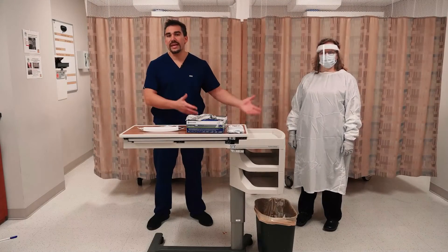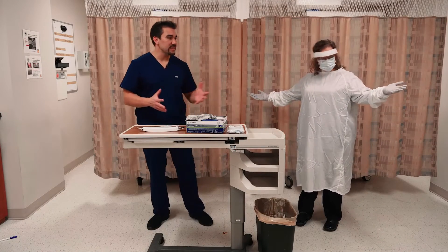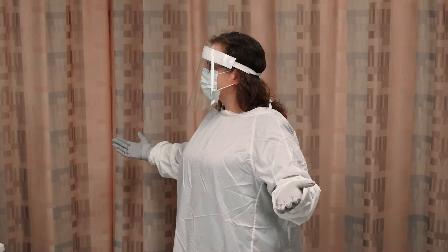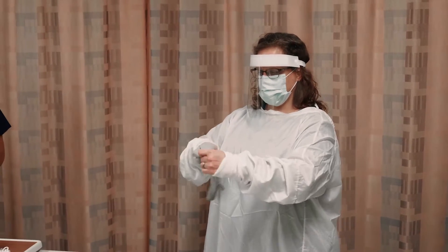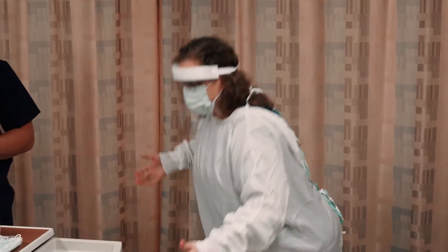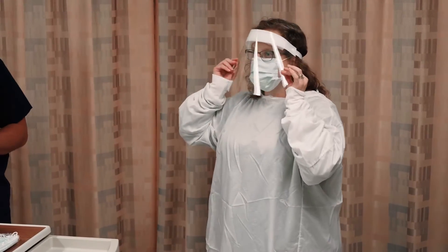Now it's time to doff, or basically take things off. Looking at Kat, first things first we're removing the gloves. Then next after the gloves is the face shield or goggles.